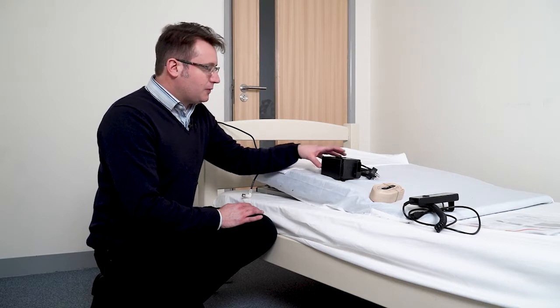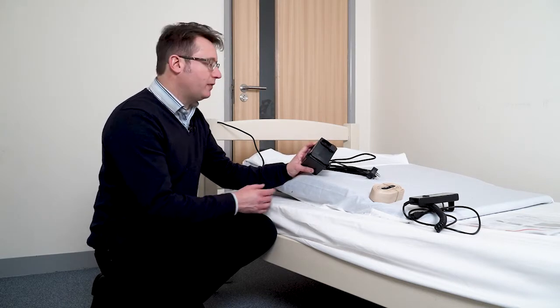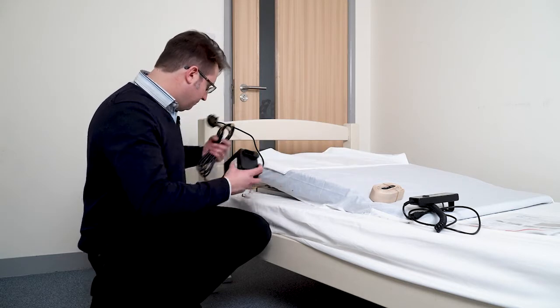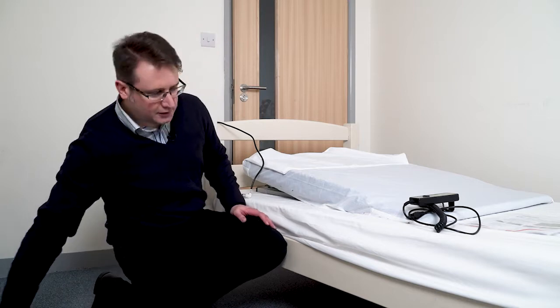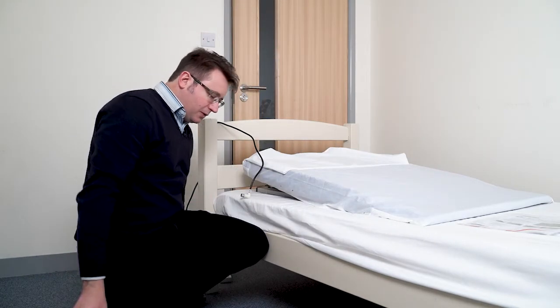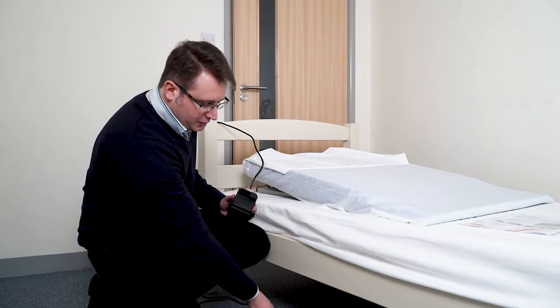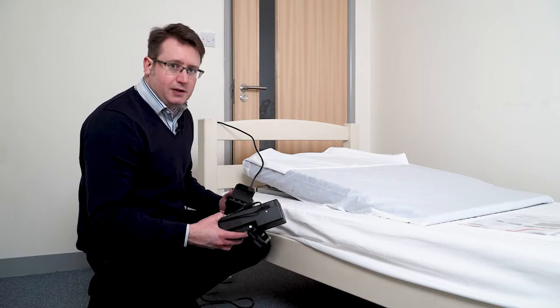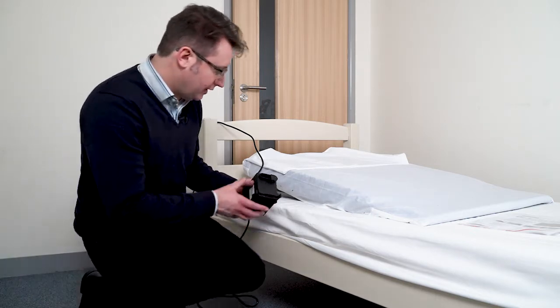The PillowLifter comes with a transformer box cable tied to the frame. It's important to remove that before installing the PillowLifter. It also comes with a strap, which we'll talk about later, and it comes with a 2-button hand control. Now I'm going to use the transformer that we've been supplying for the last few years, but in the next couple of months there will be an updated version of the transformer, which is quite self-explanatory really.